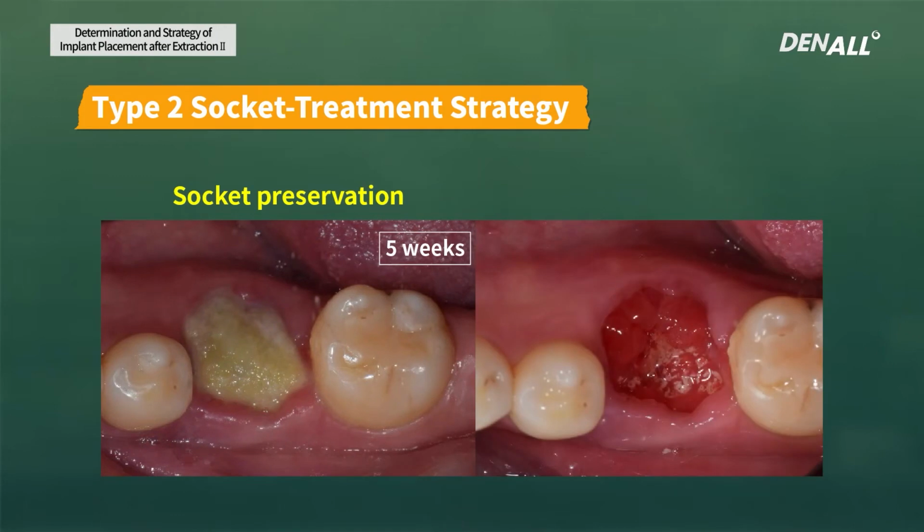this is after. There was no infection. Below the membrane, you can see that the soft tissue has filled in, and the graft, it looks a little bit exposed, but you don't need to remove it. You can just sterilize it and observe it.